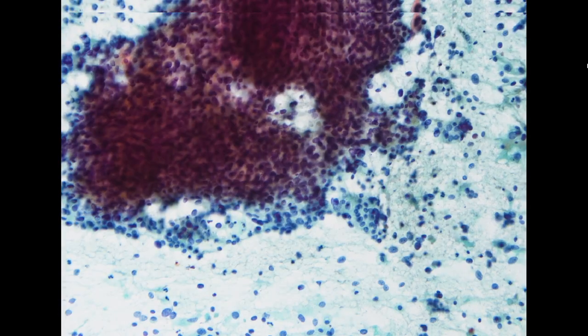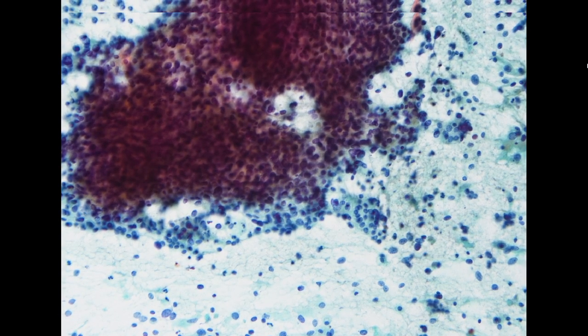Atrophic smear is one of the nightmares in the Pap smear because you can see a lot of very dark staining cells with high NC ratio. But the majority of them are actually parabasal cells. For atrophy, we usually see large fragments of parabasal cells with darker nuclei and increased NC ratio.